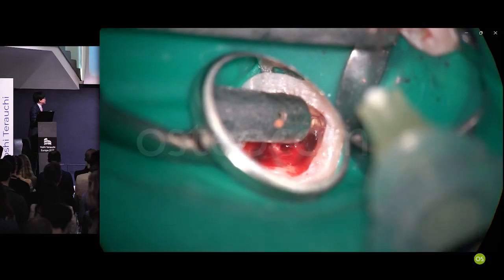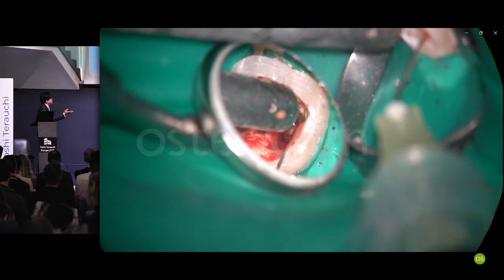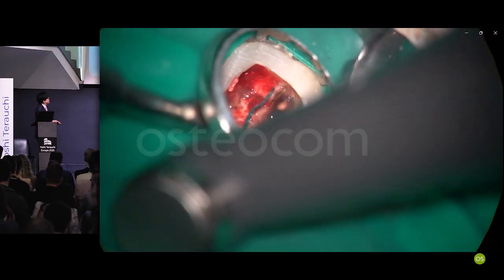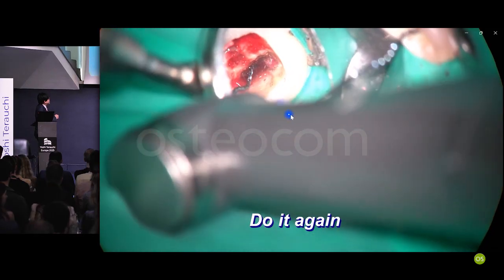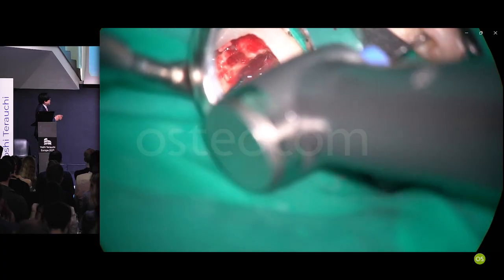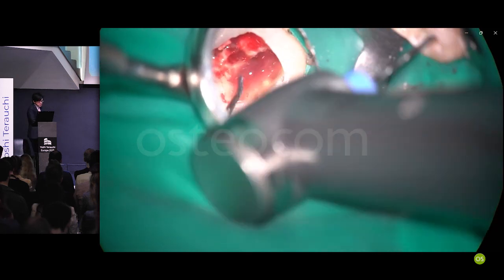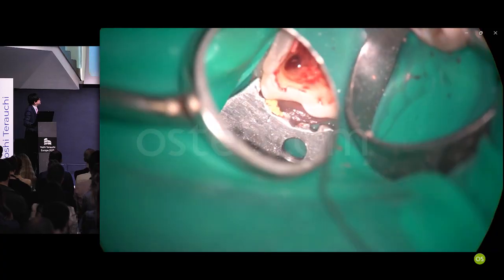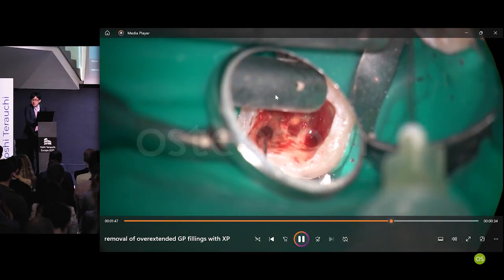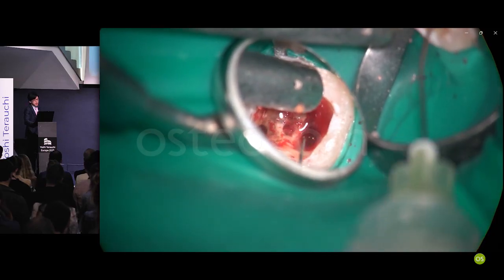I want you to hear the sound because I want to make sure the patient is not screaming, because I didn't anesthetize the patient. I'm spinning the XP shaper outside the root. That's why you see lots of blood coming out. Lots of blood. No sound? Okay.